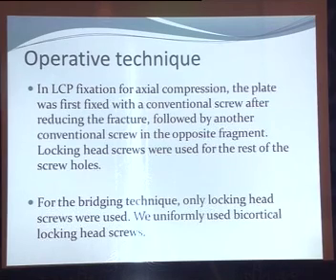In LCP fixation for axial compression, the plate was first fixed with a non-locking screw after reducing the fracture, followed by another conventional screw in the opposite fragment. Locking head screws were used for the rest of the screw holes. And for the bridging technique, only locking head screws are used, uniformly bicortical locking head screws.